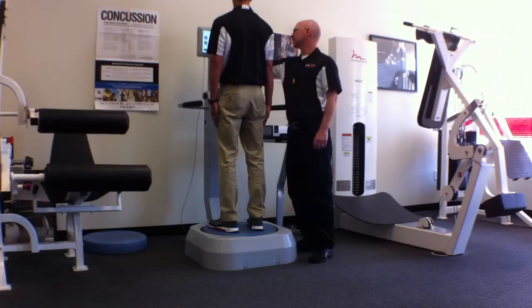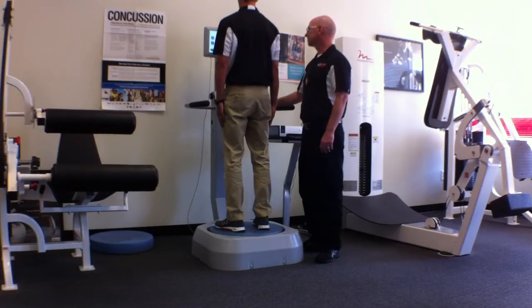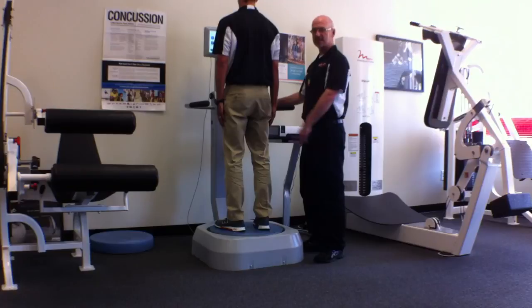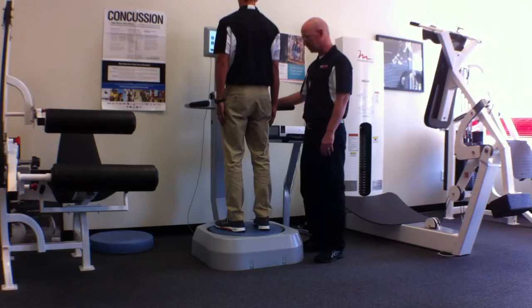You ready? Okay. You're going to stay as still as you can. Try to keep that dot right in the center. It's going to go about 20 seconds, and then after the 20 seconds, it's going to return to a stable position. Okay, he's going to get a 10-second rest break so he can relax. Try to keep their feet in the same position because otherwise you have to reset them. So make sure you instruct them to hold their feet still.